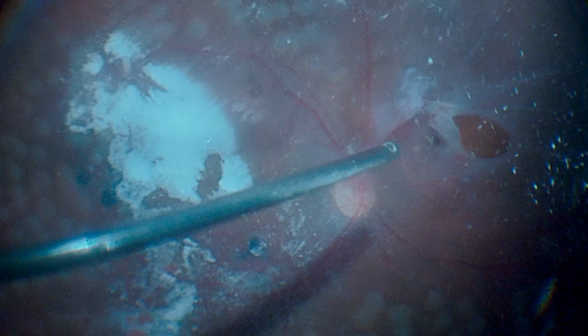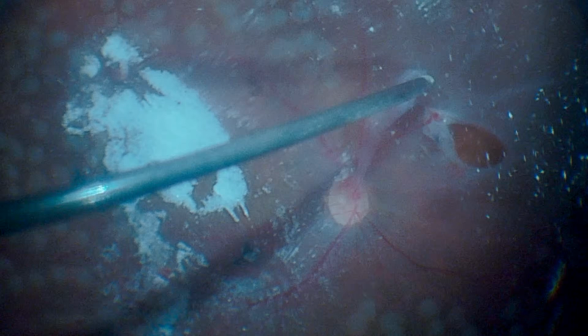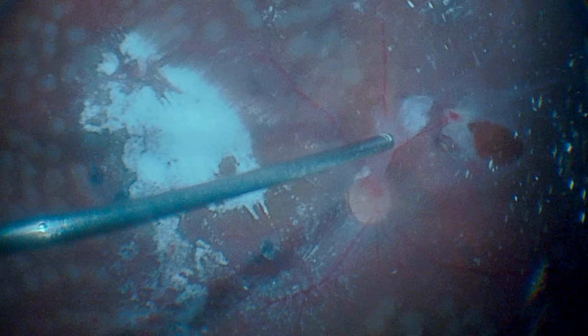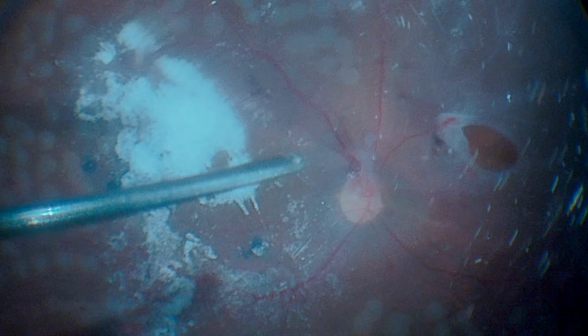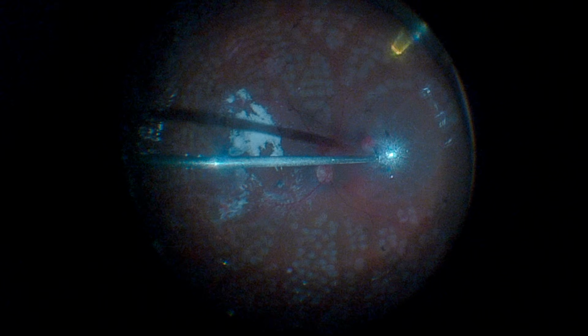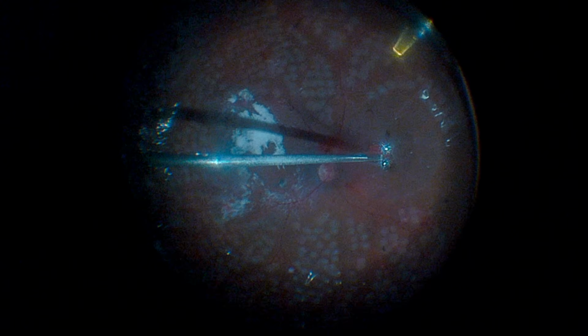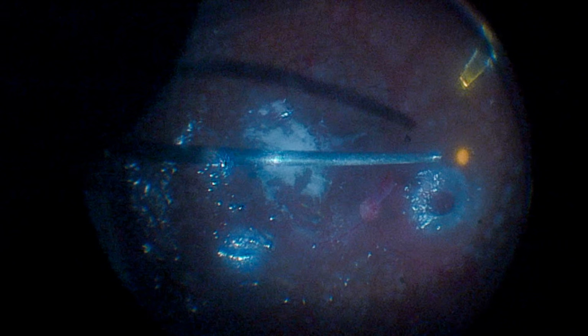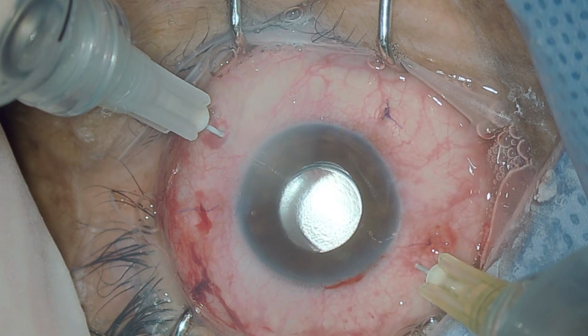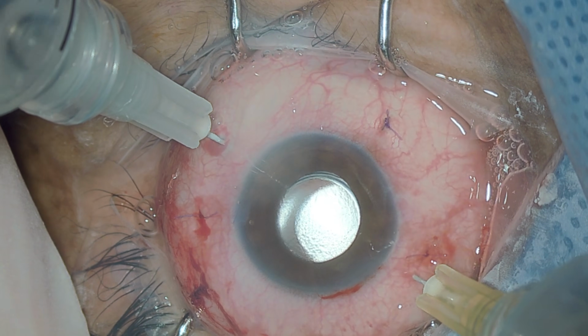Segmentation of the nasal traction connecting the optic nerve to the retinal tear is then performed, with possible hemorrhage. A fluid air exchange is carried out, and the retinal tear is treated with endolaser. A good final aspect of the retina is observed, with no areas of preretinal hemorrhage. Finally, C3F8 gas is used as a tamponade.